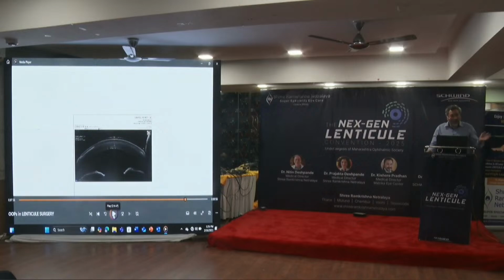So VIP cases will happen with doctors, ministers, or somebody like this. What happened was she had a flap dislodgement, and what you see over there is an epithelial ingrowth with some fibroblastic tissue. We scraped that 3 or 4 times and we put the flap back. I even brought this patient to Bangalore. Dr. Rohit and I worked on it, on and on, up and down, and at the end, what happened? A fibroblastic membrane growing onto the gap.